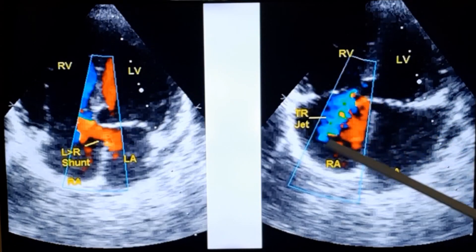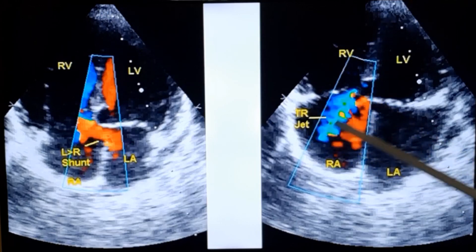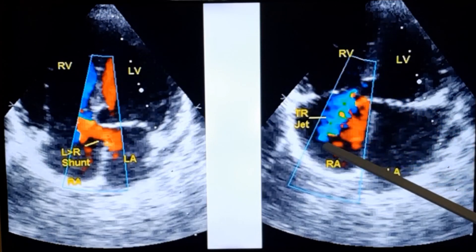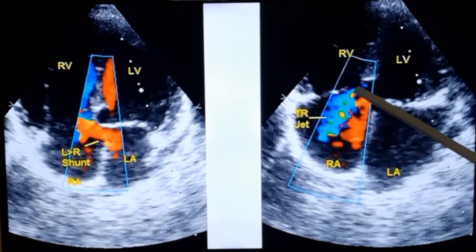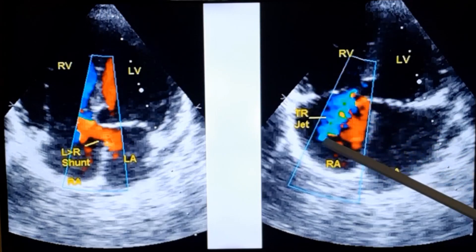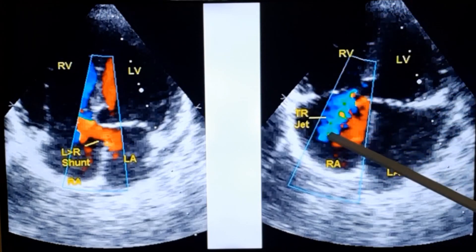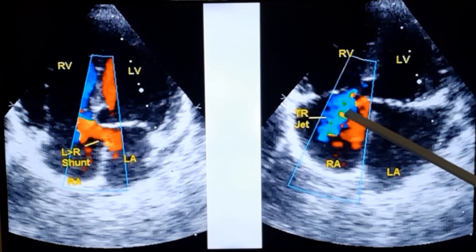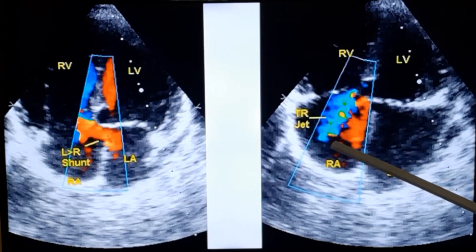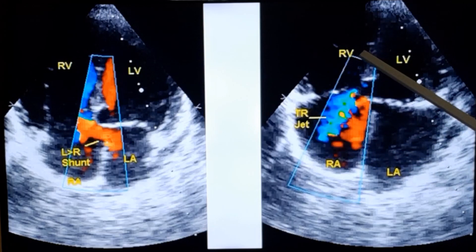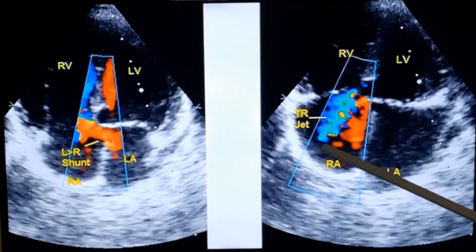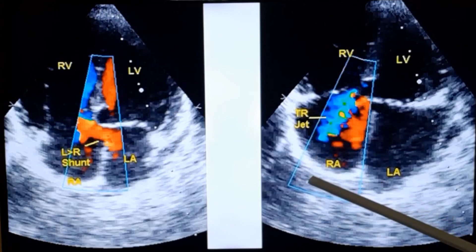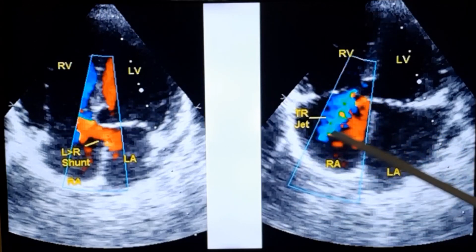This is tricuspid regurgitation — reverse flow from the right ventricle to the right atrium. The flow is blue because it is moving away from the transducer. It has multiple colors — mosaic — and mosaic color indicates turbulence. When the right ventricle contracts and pushes blood into the right atrium, that is usually a higher velocity jet which produces turbulence.